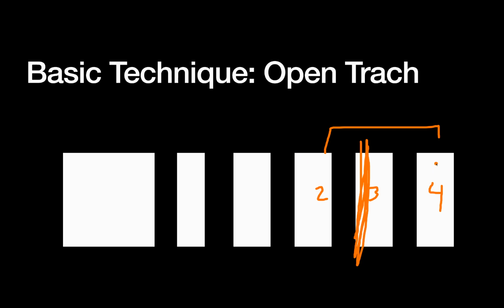If you go too low, you run the risk of a tracheoinnominate fistula. Once you get down here and you found the rings you're interested in, you want to place some stay sutures. That's usually described as a figure of 8, where you go in and out, right? A stitch on either side of the third tracheal ring. These stay sutures can be used to hold up that cartilage when you go to put the trach in.